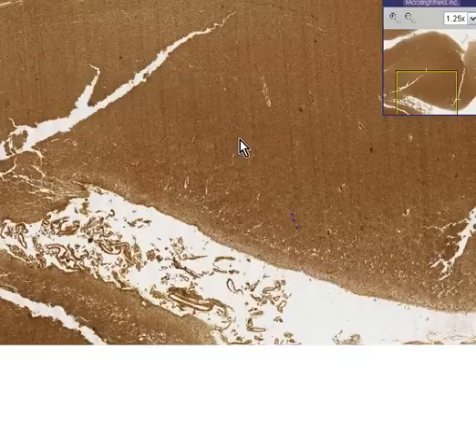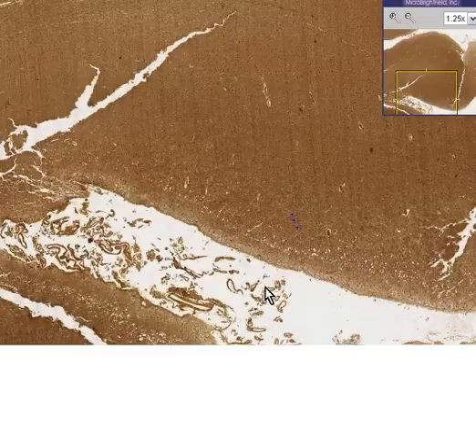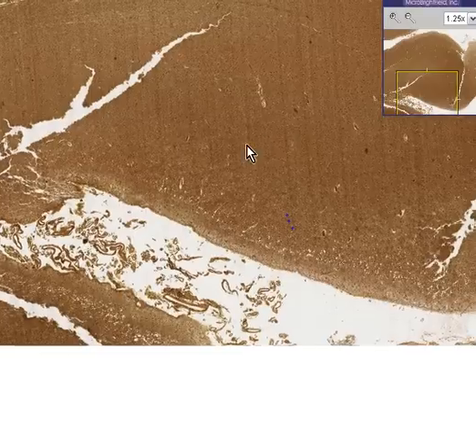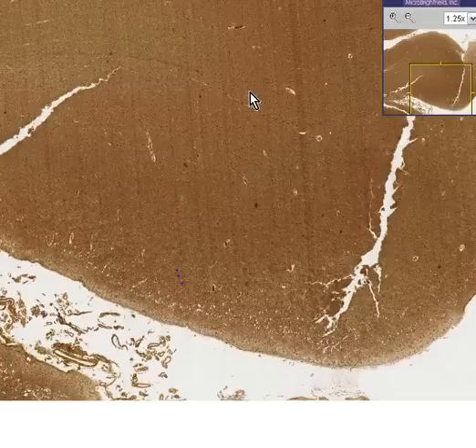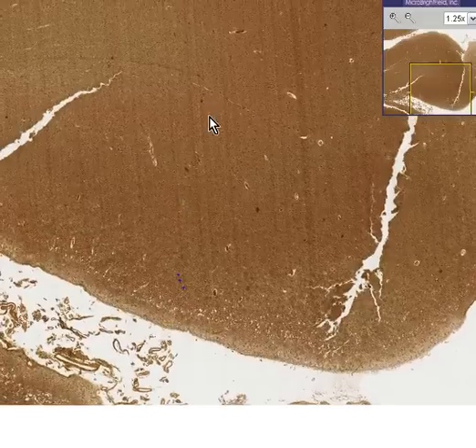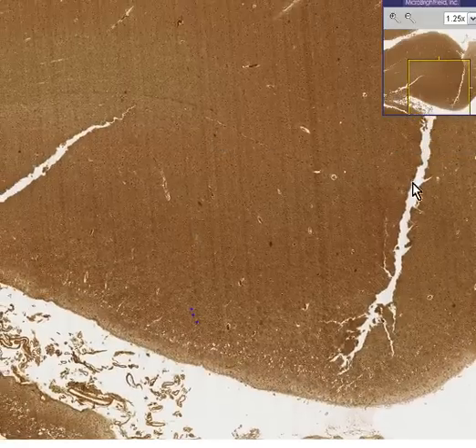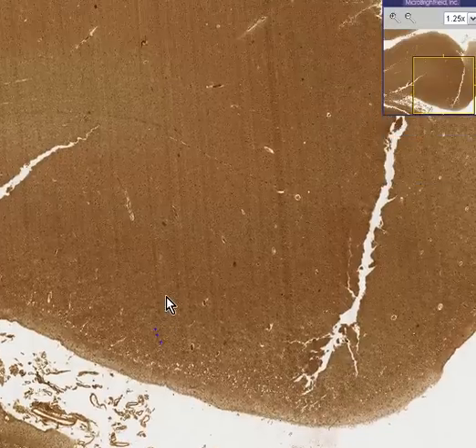It's stained with a special stain that emphasizes neural processes. Nevertheless, please note you could tell that here is an area of meninges, and basically this is the brain cortex, and you know that these little jagged clefts are nothing but artifacts of tissue processing.